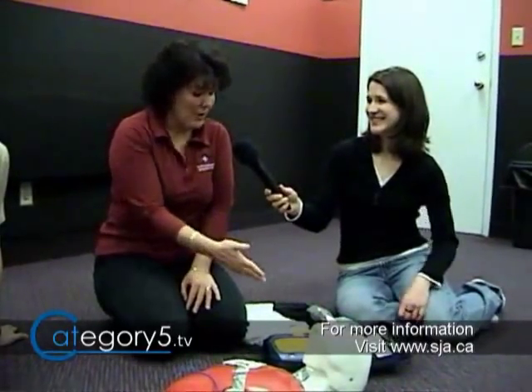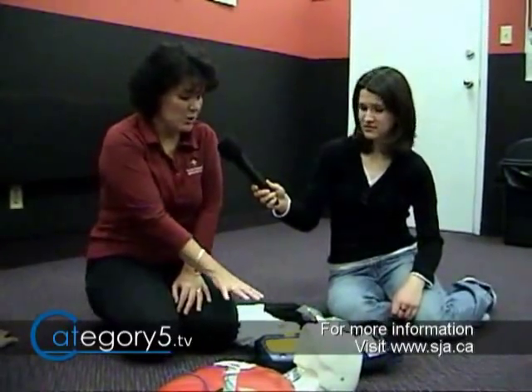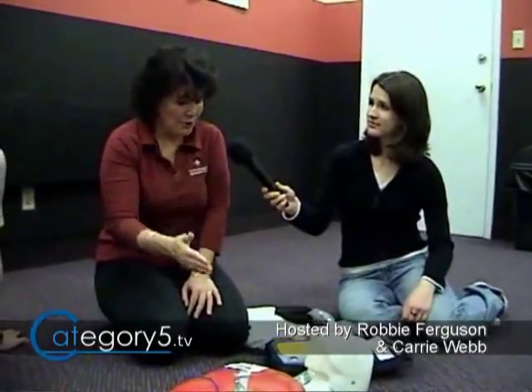If the rhythm isn't shockable, the machine will say 'no shock advised,' and then you look for any signs of life — movement, coughing, vomiting. If there's no sign of life, start CPR and keep doing it. When you use the machine, it doesn't always say shock. It could be a non-shockable rhythm. Do a couple minutes of CPR and it could put the heart into a shockable rhythm. If it says to shock, we're in the process of saving them. If it says don't shock, we just do CPR.